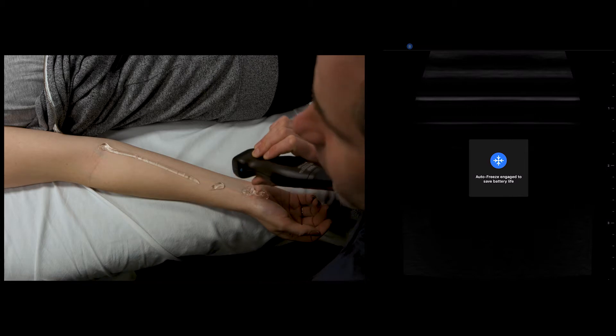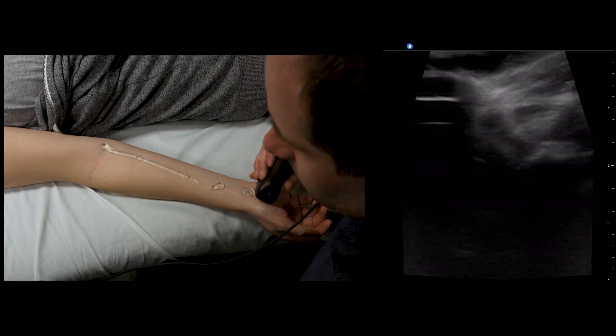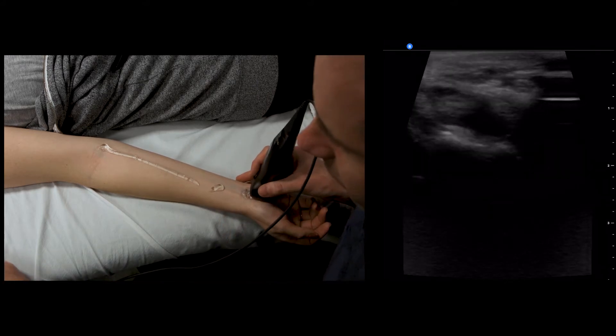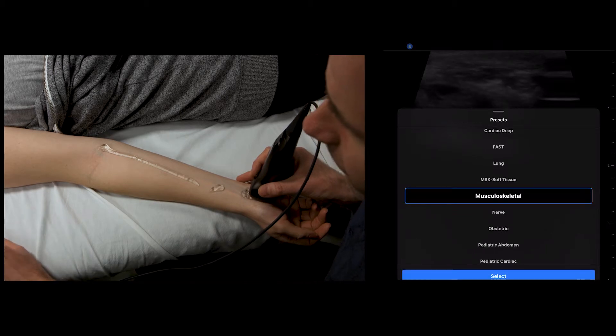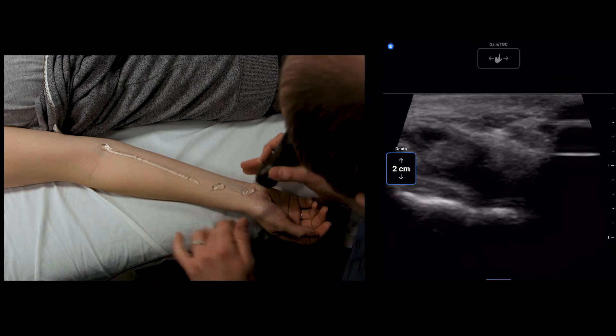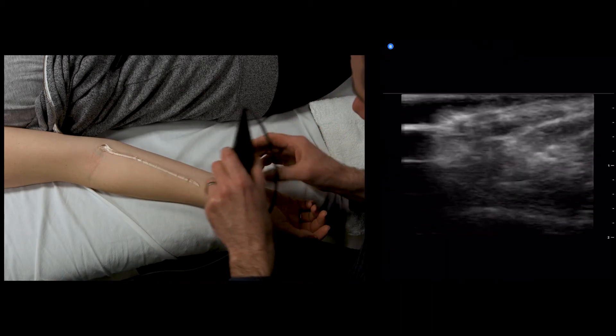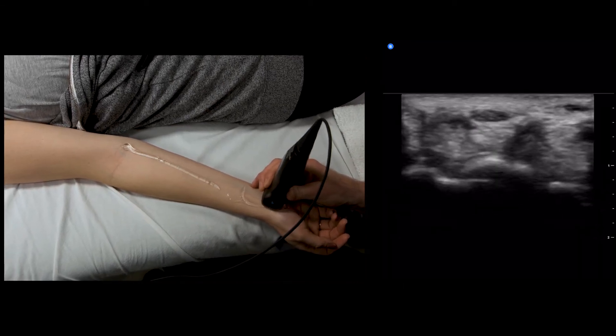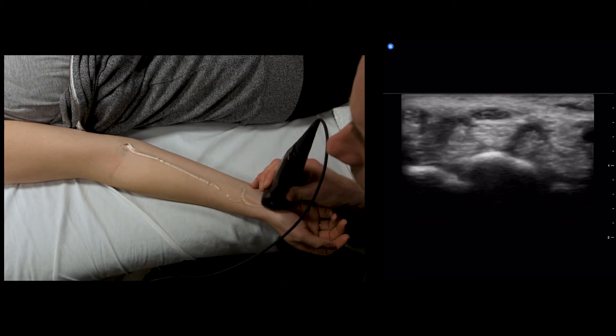Left is going to be on the left side of the screen. First thing we want to do is take our preset, go to a musculoskeletal preset, and decrease our depth a little bit. Here's the median nerve.